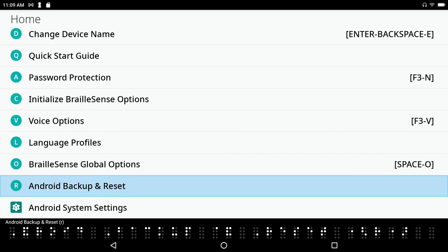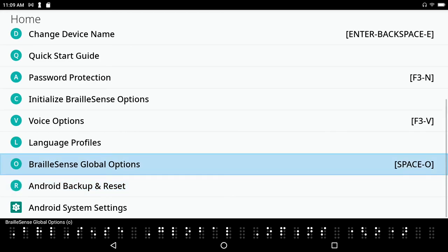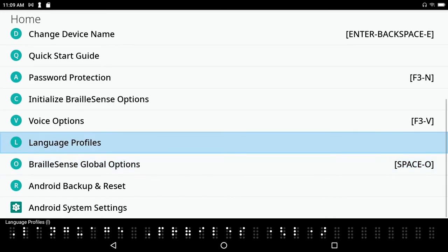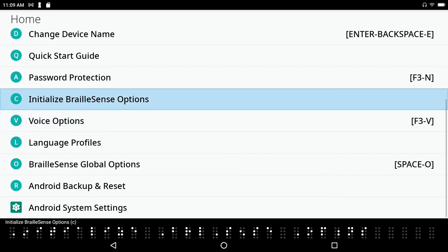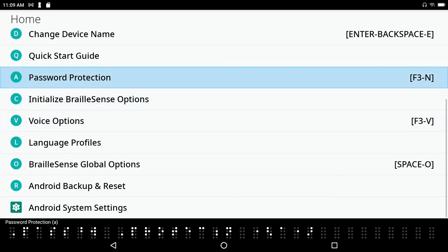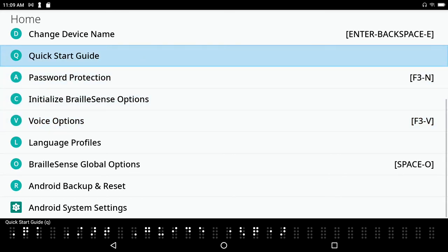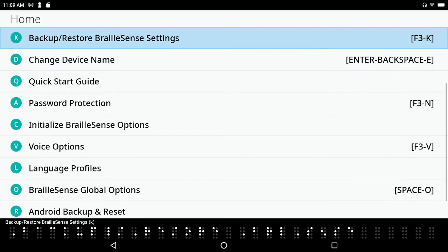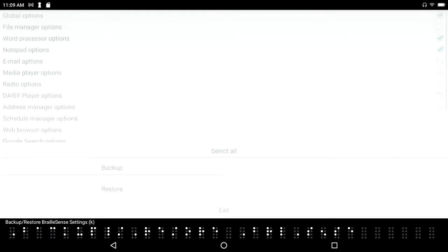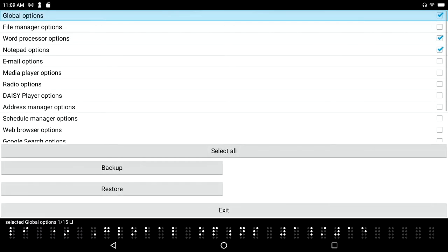BrailleSense global options - there's BrailleSense global options, language profiles, voice options. I just keep pressing space with dot 1 to move up: initialize BrailleSense options, password protection, quick start guide, change device name, backup restore BrailleSense settings. And I hear that the hot key is the letter K, so I could have just pressed letter K and got into this menu.